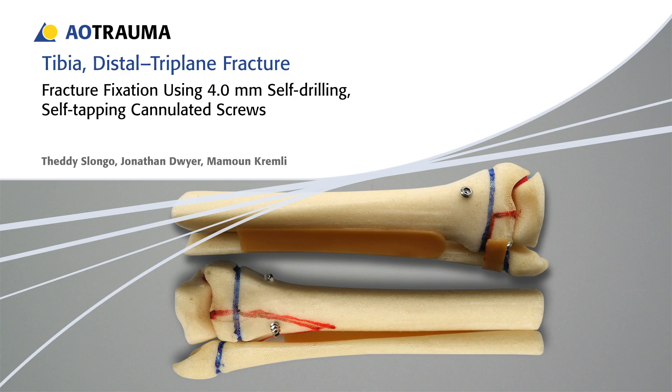In this exercise, 4.0 mm self-drilling, self-tapping cannulated screws will be used to demonstrate the technique for the fixation of a triplane fracture of the distal tibia.